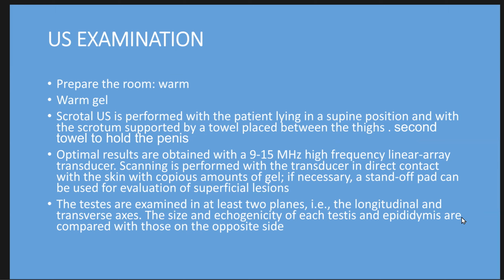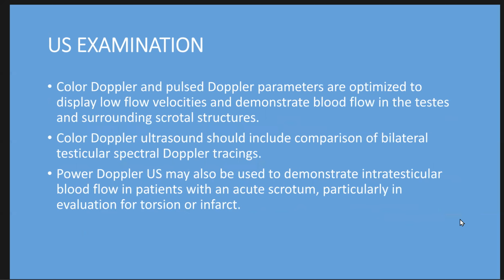The testes are examined in at least two planes, the longitudinal axis and the transverse axis. The size and echogenicity of each testis and epididymis are compared with those on the opposite side.